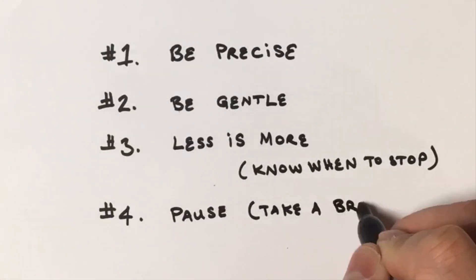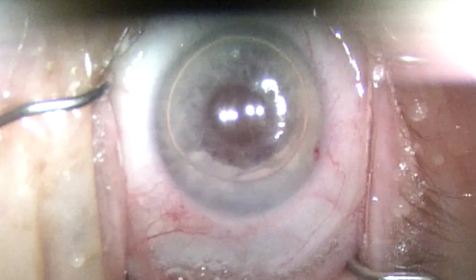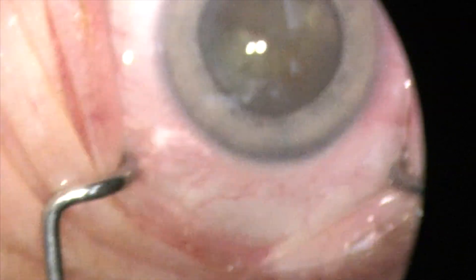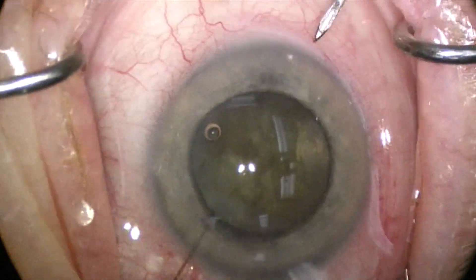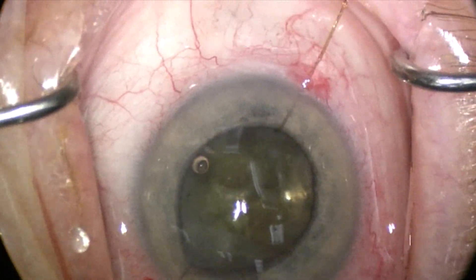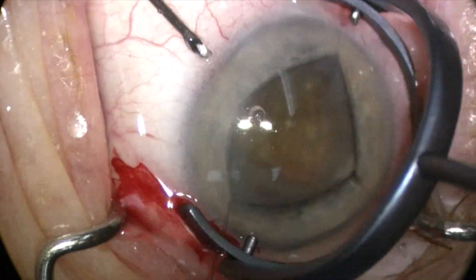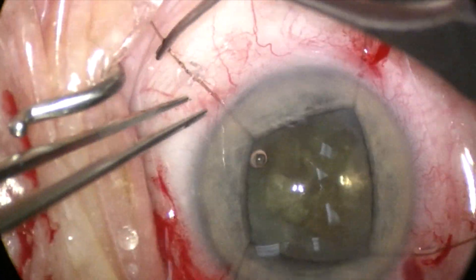Tip number four: Pause. Take a breather. Intracameral gas can be helpful in select cases to keep the iris away from the incisions. Don't be afraid to stage the procedure and come back later, especially in monocular cases. In this video example, coming back seven days later gave the patient's iris enough time to recover, with full iris recovery and pharmacologic dilation, allowing safe placement of retention iris hooks as a precaution under direct visualization of the anterior capsule. This way we avoided the risk of ripping the anterior capsulorhexis when the pupil was small.